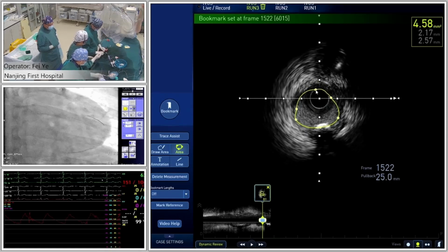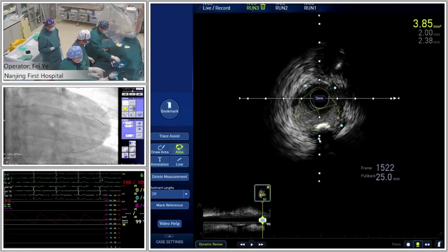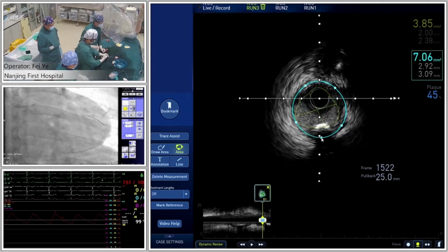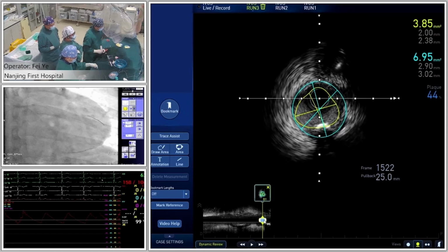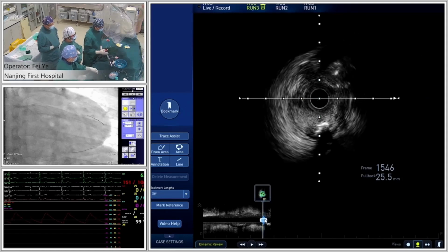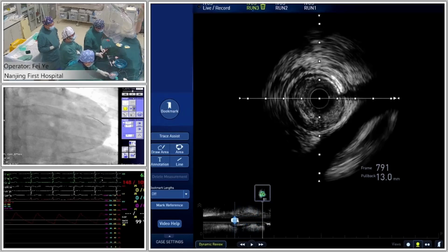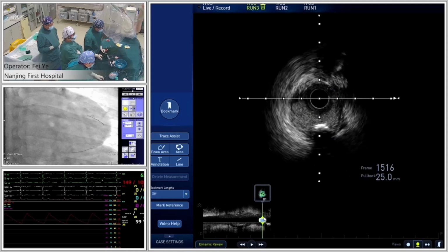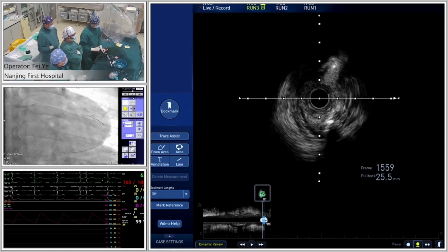No, here still we should go more proximal. It's not so ostial OM margin. Go a little proximal. Pull down. A little more proximal, because it's nearly a 90-degree angle. Yes. Proximal. No. Go a little back. Yes, here. A little proximal. Little more. Still. Yeah, here.